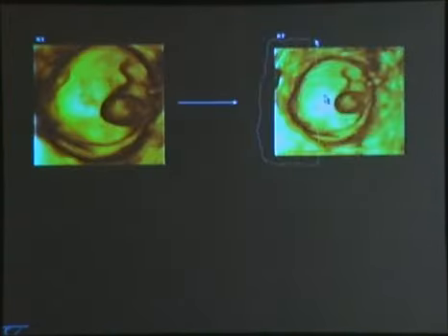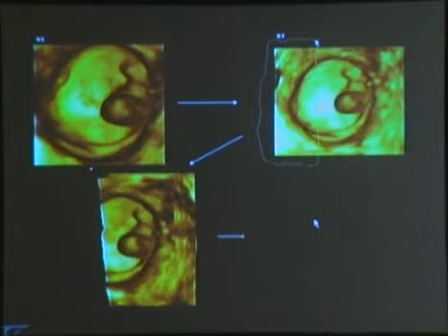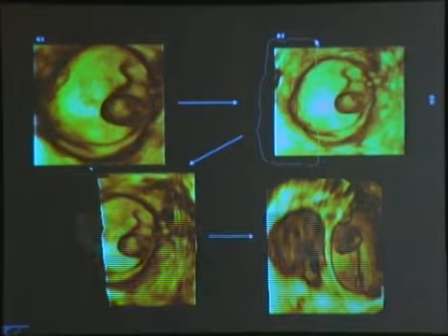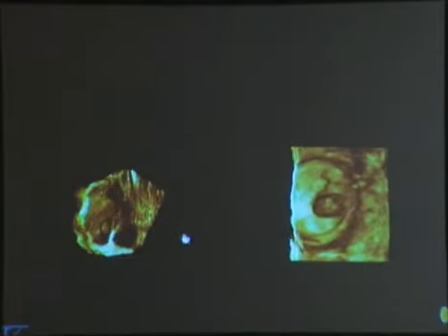So when you take the cutting tool and cut off part of that ovary and then move it around and look at it from the inside, you will see that even this one has pretty small but multiple papillary formations that make this ovary pretty suspect of a malignancy. So that can be done very easily the moment you move around the volume.